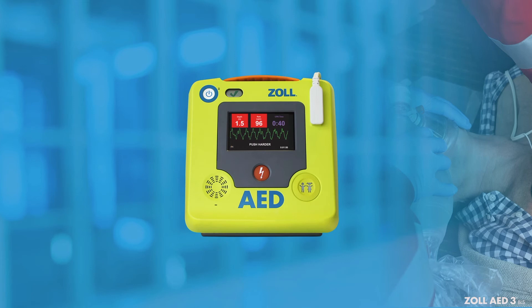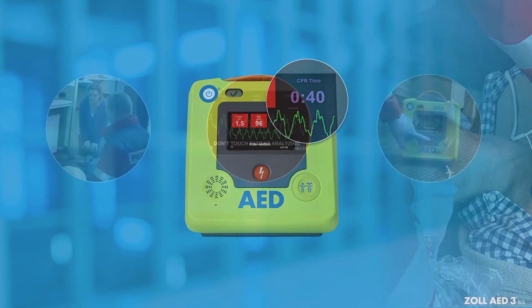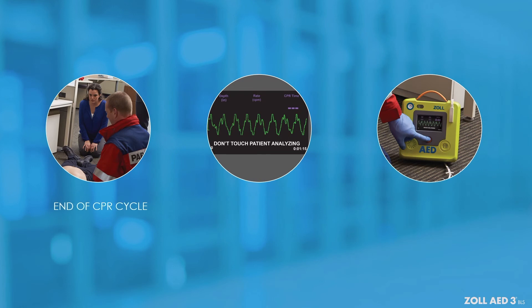If a shock is not advised, or after a shock has been delivered, begin CPR. During the rescue, the CPR dashboard will provide real CPR help to deliver high-quality CPR for adult patients. The CPR countdown timer will display the time left in the current CPR period. At the end of a CPR cycle, the Zoll AED-3BLS will analyze the rhythm again.